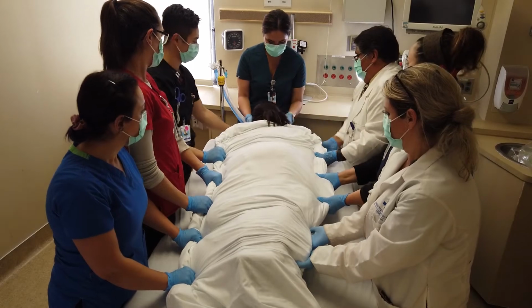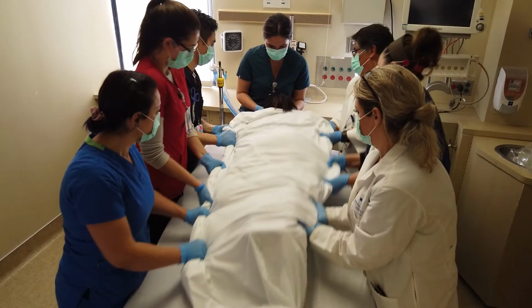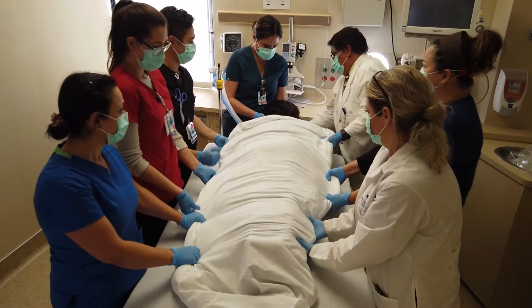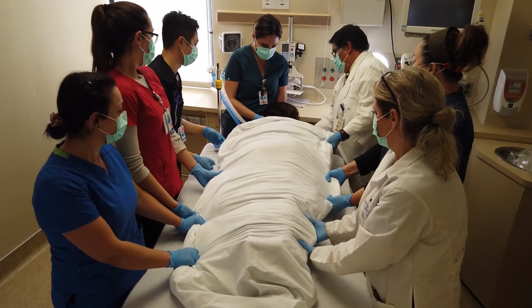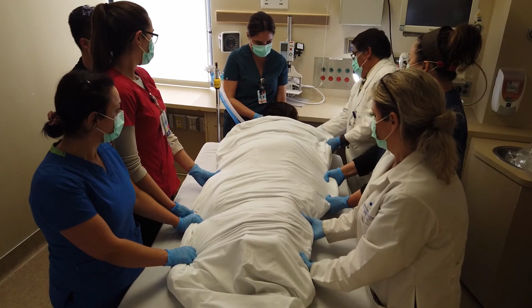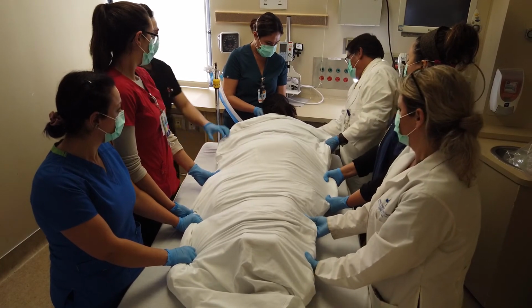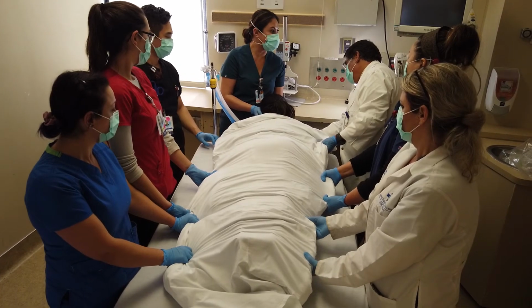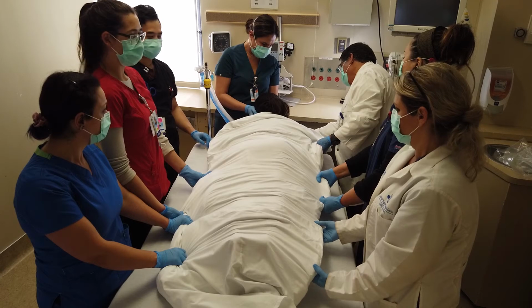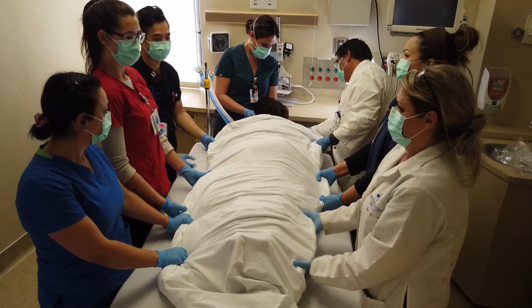Once prone, the patient needs to be realigned to the proper position where the head and ET tube are properly placed on the prone pillow on top of the head. The person at the head of the bed needs to make sure that they are stabilizing the neck by making a C-collar out of their arms, while another RN will reposition the prone pillow to secure the ET tube in the patient's head right side up.